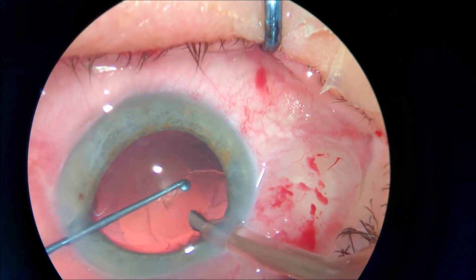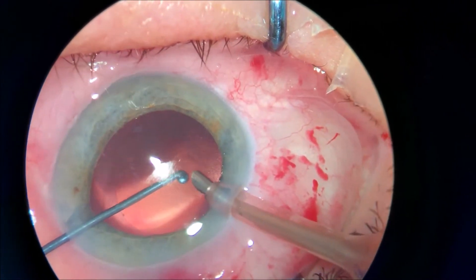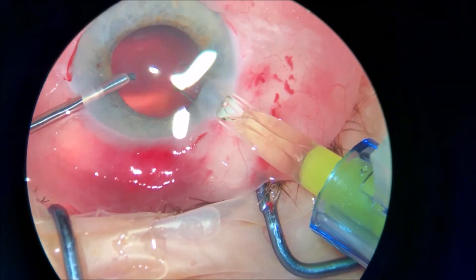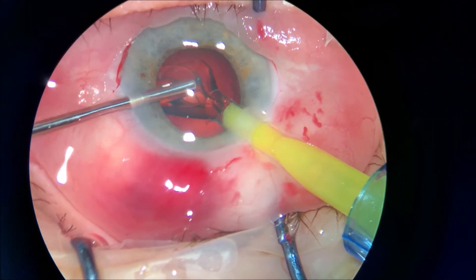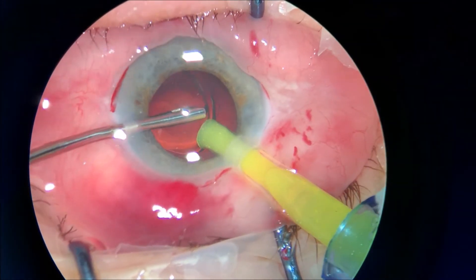If you try to perfect your surgery and if you don't rush in these moments, injecting the IOL under irrigation will save a lot of cleaning up the anterior chamber from the remnants of viscoelastic.